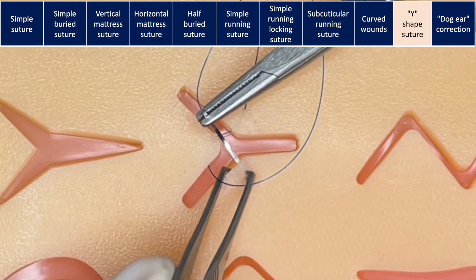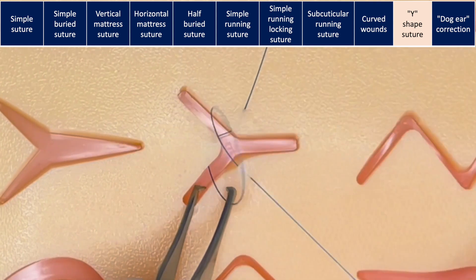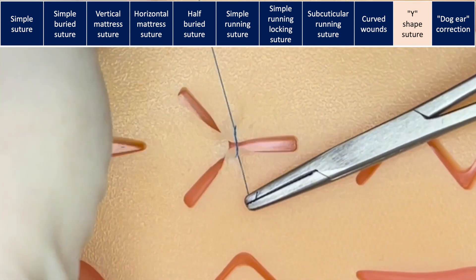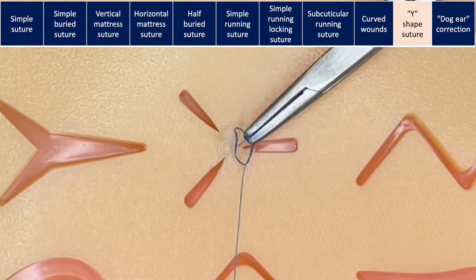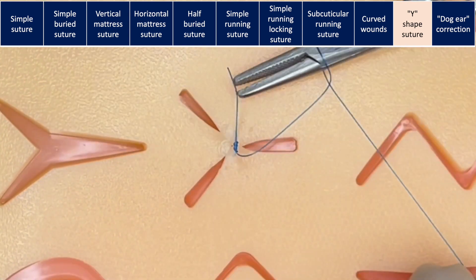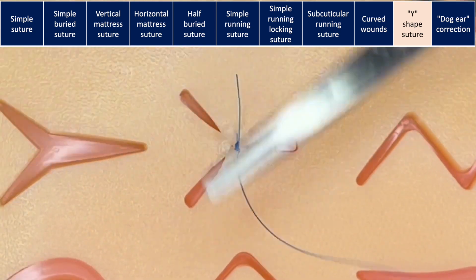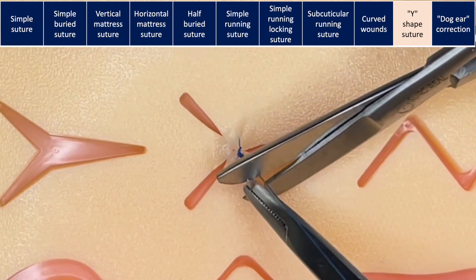Then you come back through the other corner of the wound. Enter in the dermal layer and exit through the skin, keeping the same distance from the edge as the suture on the opposite side. Then, tying the knot will bring everything together. After this, you can close your three different wound segments in the way that you prefer: simple interrupted suture, horizontal mattress, or simple running suture.